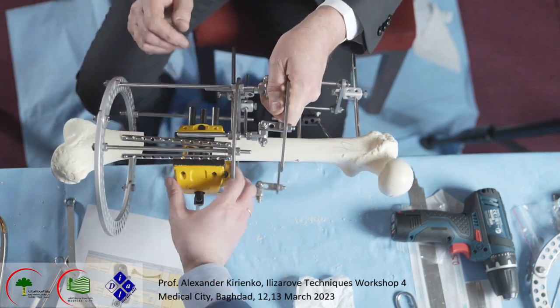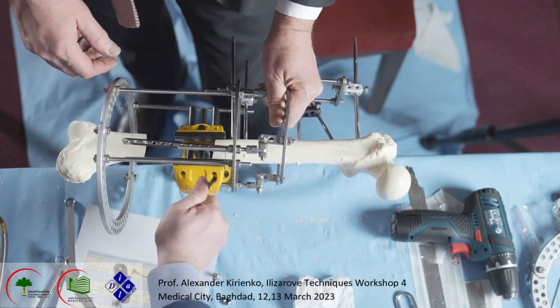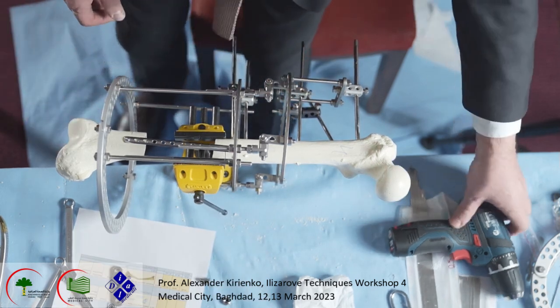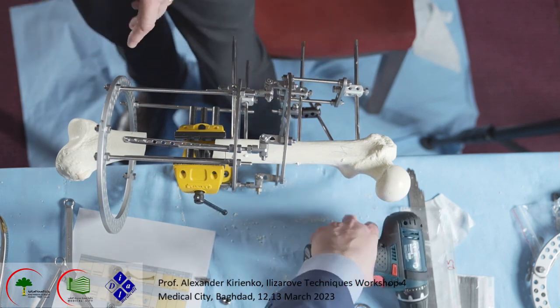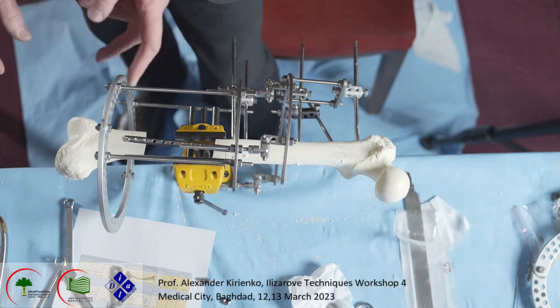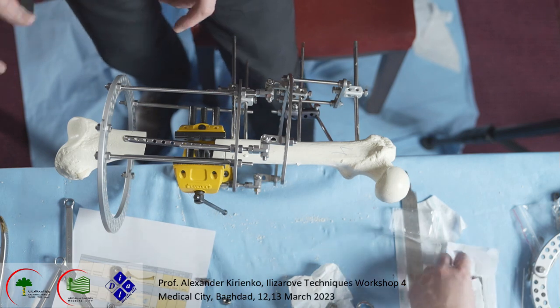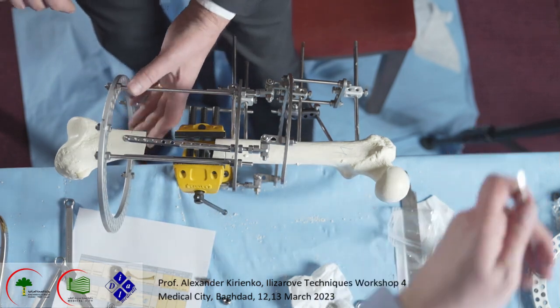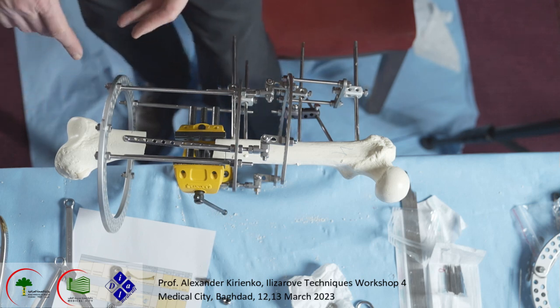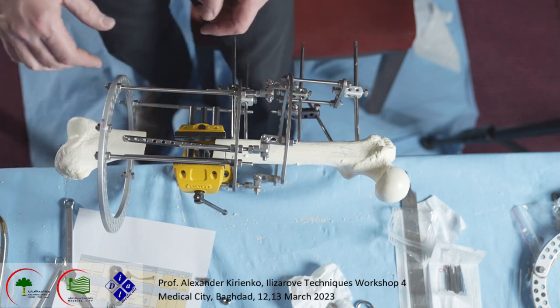How do we do this? We start maybe with a wire. Put any wire, smooth wire maybe. And like I said before, when we put in the wire on the distal femur, we always should control the knee flexion, because the displacement of soft tissue is completely different when the knee is flexed and when the knee is extended.